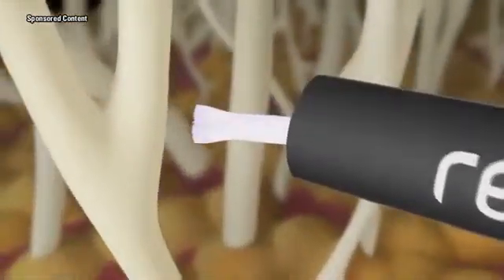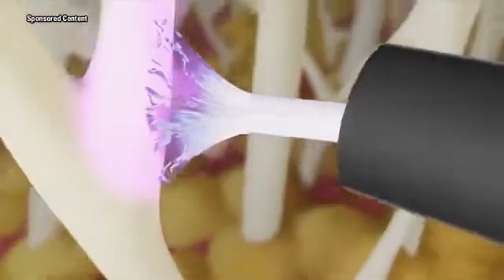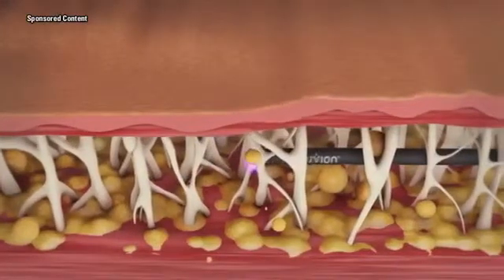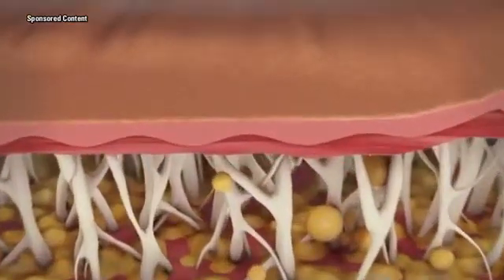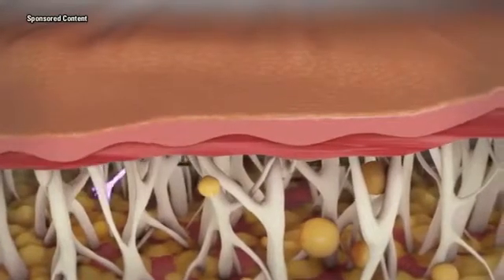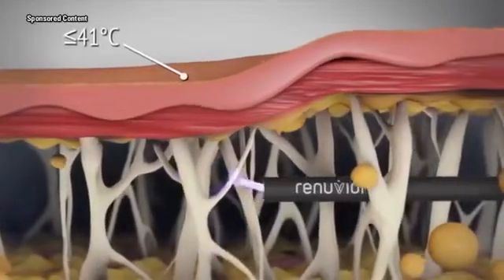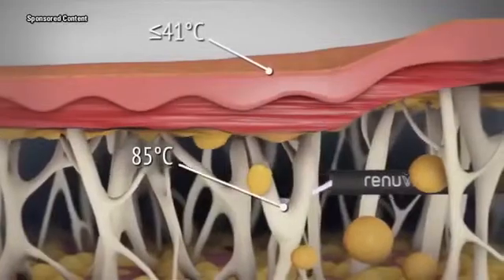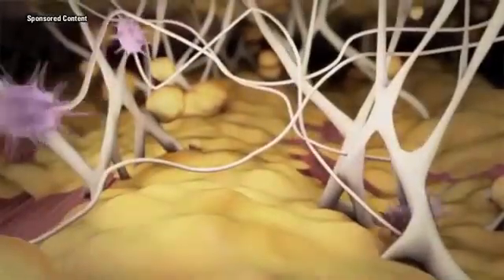What is it doing? What it's doing is using electricity and radio frequency to shrink those bands so that everything looks tighter. Okay, so the bands are what is holding our skin and fat together? Explain that. I'm trying to work it out. The skin, fat, and the underlying muscle, basically. Yes. Okay, so what we're looking at, the white lines, is that the muscle? The white lines are those little bands. Okay. So the muscle is below us, the skin is up on top, and you can see the skin over top shrinking down as that electrical pulse tightens everything.